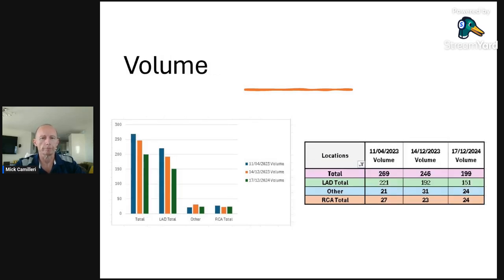This is where it gets interesting: volume. So volume is the amount of space that the plaque takes up. Noting that we had 4 lesions in my case. If it was all in one location, it'd be a big solid mass, probably taking up more space in the artery if it's just one location. If it's spread out over different points in the arteries, then it's going to block the artery a little bit less because it's spread out a bit more for the same number, that is. But anyway, let's get into the numbers here.